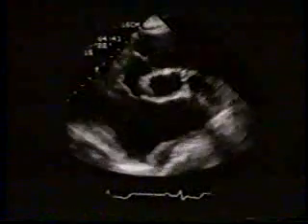Main pulmonary artery was ligated at this point here. Dilated left atrium is evident along with prolapse of left atrioventricular valve. Here is the outlet foramen, which is widely patent without any evidence of subaortic obstruction. Observe these features in real time and note marked degree of prolapse of the left atrioventricular valve.